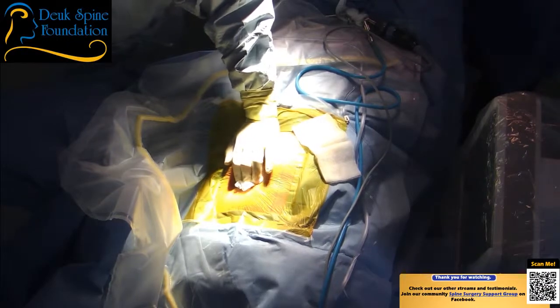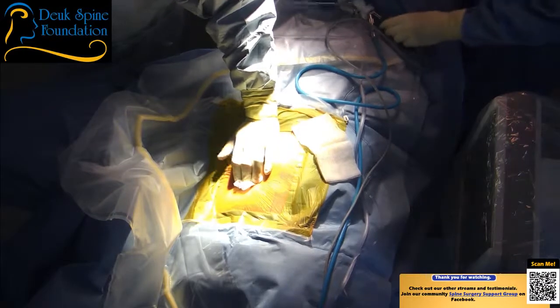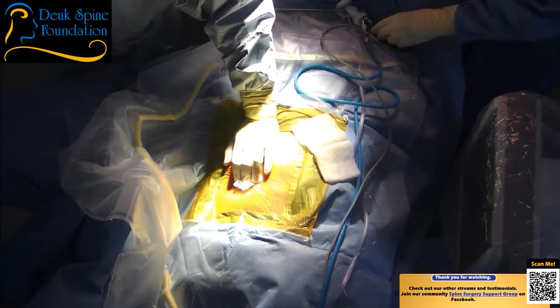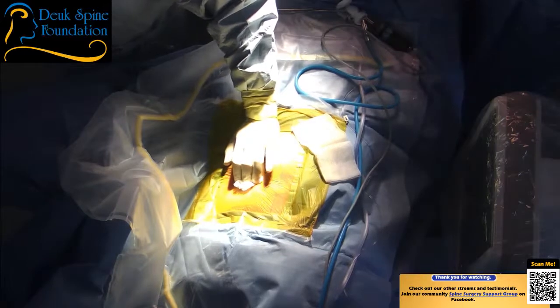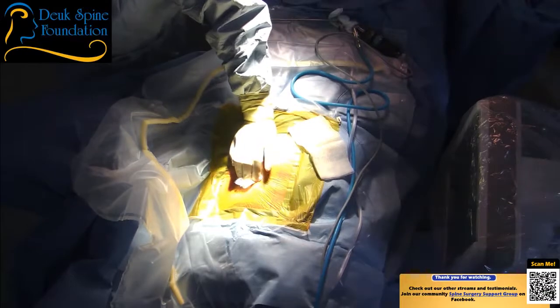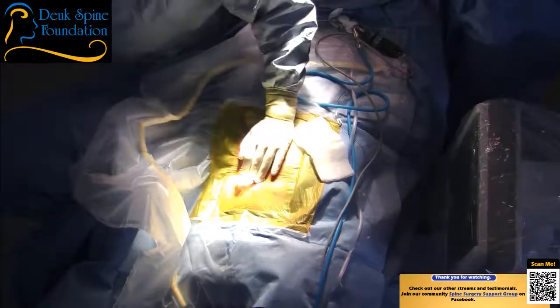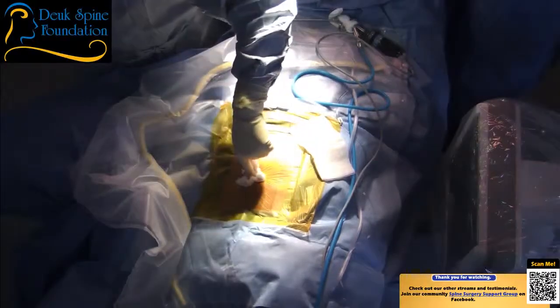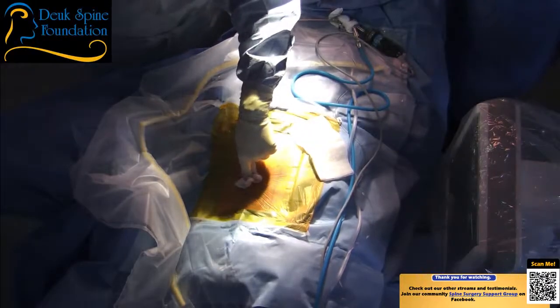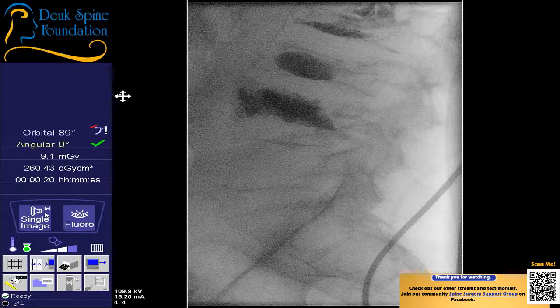Let's see what we can do on this x-ray. Let's try to wag the x-ray a little bit, see if that improves the picture. I don't know if he's moved a little. Let's go ahead and wag it a little bit, just like 1 degree, and get a shot. See if that makes it better or worse. Actually, it looks better to me.